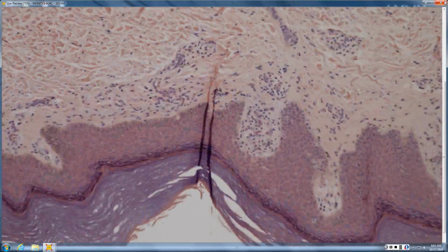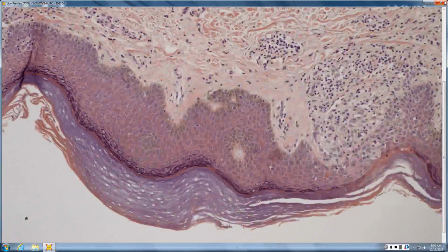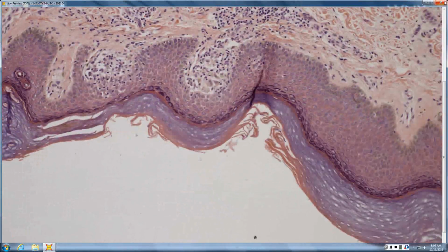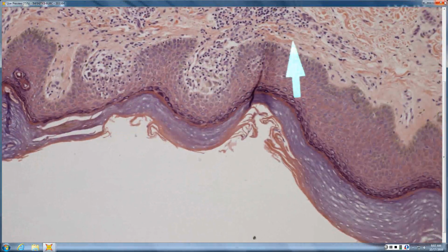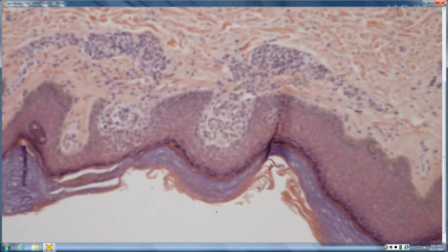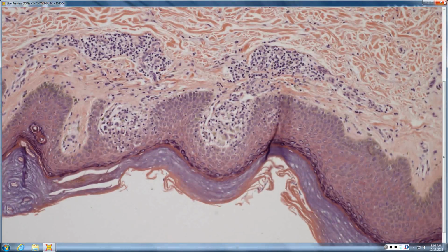So MF, and then the PLEVA, pityriasis lichenoides, early evolving stage of a benign lichenoid keratosis. And this one, what are you seeing above the postcapillary venule here? You've got your potbelly pig sign there. So you have pigment, but you also have papillary dermal fibrosis. That suggests this is something subacute or more chronic, more long-standing, with epidermotropism of lymphocytes, lymph in every hole. I'm going for MF. Let's send this to Mayo. So probably mycosis fungoides. Very good.